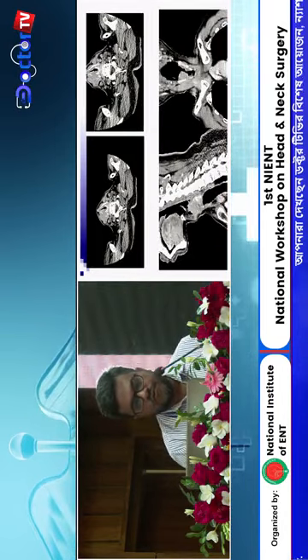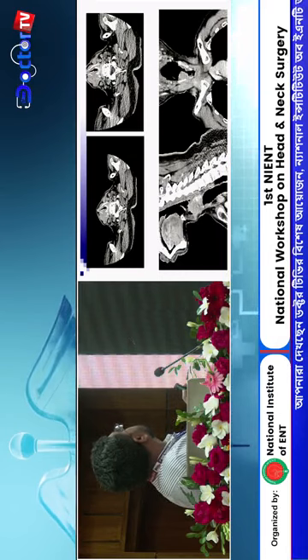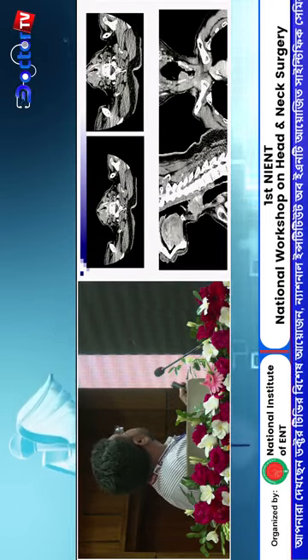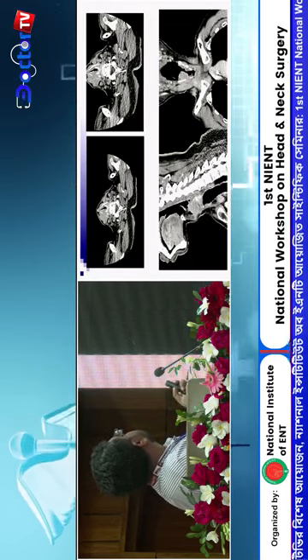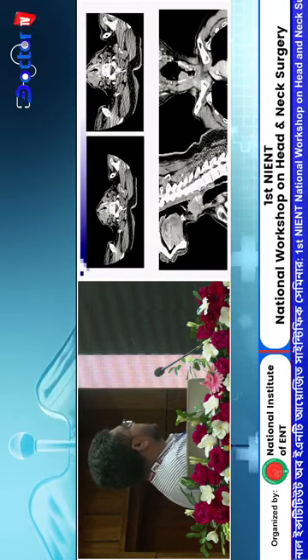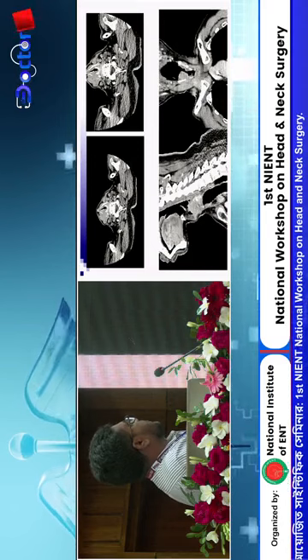And this is also a T4A tumor. The supraglottic glottic tumor erodes the right thyroid cartilage with extension into the right paraglottic area. There are multiple enlarged lymph nodes at level 3. Here are the enlarged lymph nodes, and there is the paraglottic extension of the tumor.